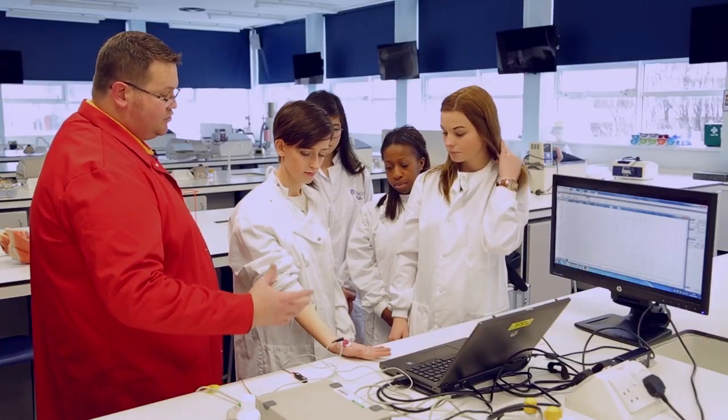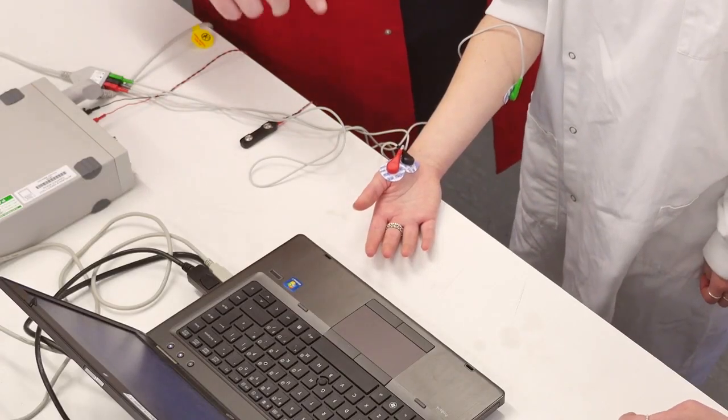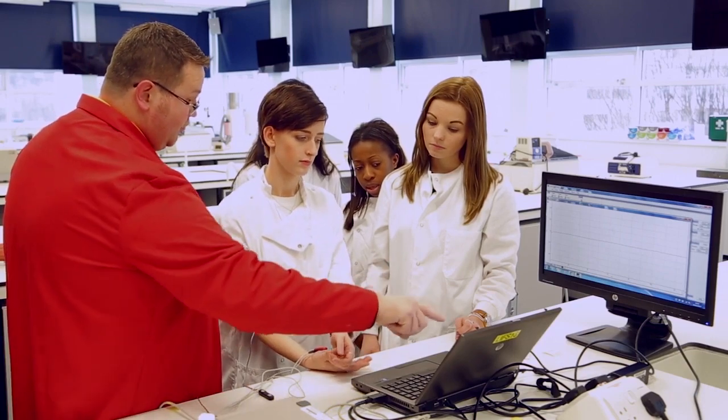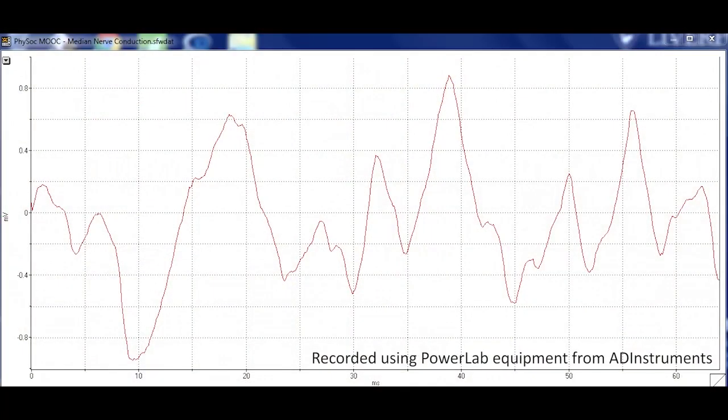We need to just make sure that our recording system is working. Give me that resistive movement against your thumb — if it's recording we'll be able to see the electrical activity of the muscle contraction. There we go, that's now being picked up through the recording electrodes, so you can see on the screens the electrical activity of your muscle as it's depolarizing and repolarizing allowing that contraction. The surface recording electrodes are picking up that surface potential.